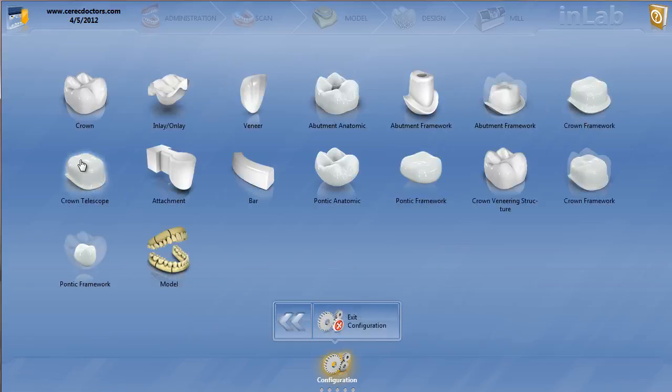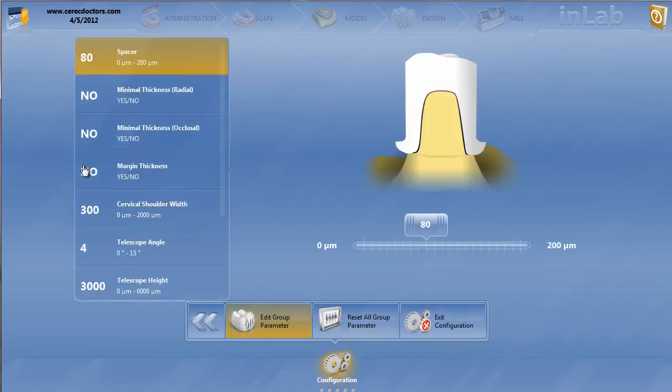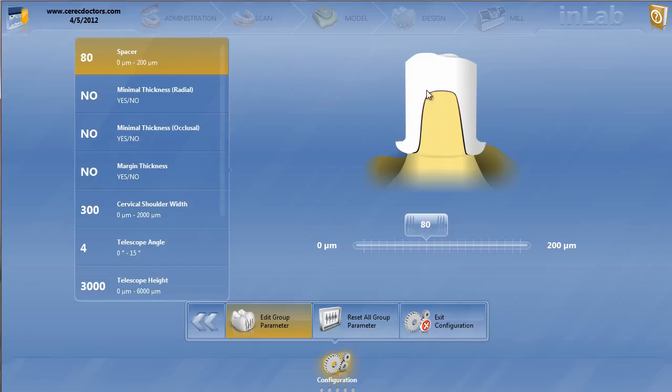A crown telescope is an interesting parameter. I really didn't have much experience with telescopes. We'll definitely go through some examples with some videos. But it's a nice little application. Telescope crowns are things that allow you to parallel different teeth. A lot of times people use them on abutments or bigger overdenture cases to create bars and things like that to make everything parallel. I've had some experiences of using these little telescope crowns over some titanium bases from Glidewell, for instance.